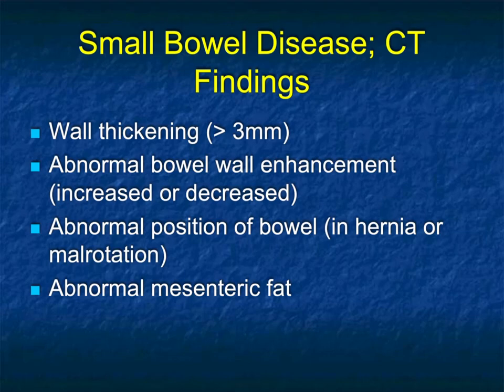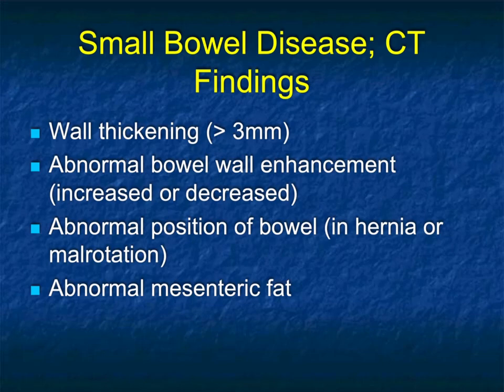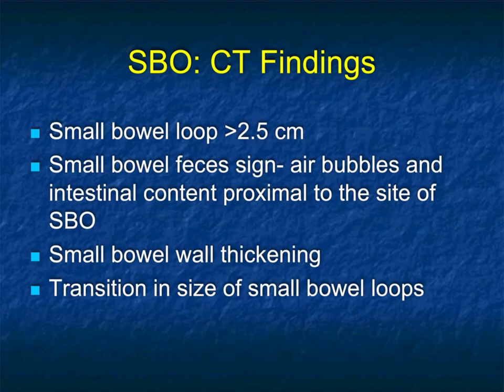We'll focus on small bowel disease. Small bowel wall thickening is typically over three millimeters — which basically means if you can measure it, it's thickened. We look for enhancement; increased or decreased enhancement becomes critical. Decreased is often with ischemia, though hyperemia can be seen in a range of findings from ischemia to infection to inflammatory changes. We look at positioning of bowel: is there obstruction, hernia, or malrotation? Other findings like mesenteric fat stranding are very helpful in pointing to areas of abnormality.